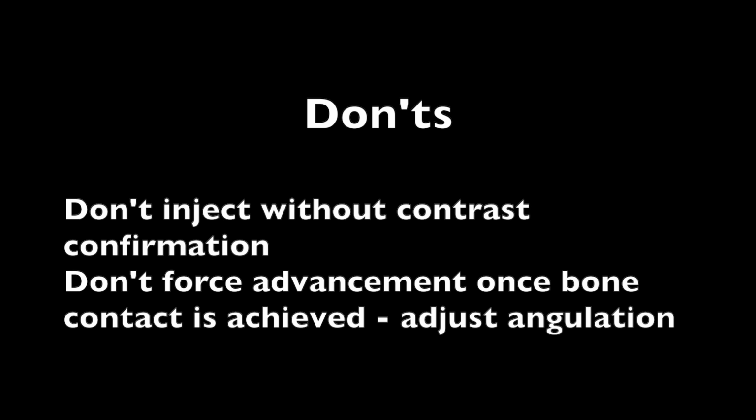The don'ts of the procedure include: do not inject without contrast confirmation, and do not force the needle once it contacts bone of the superior articular process. Instead, readjust the angle.